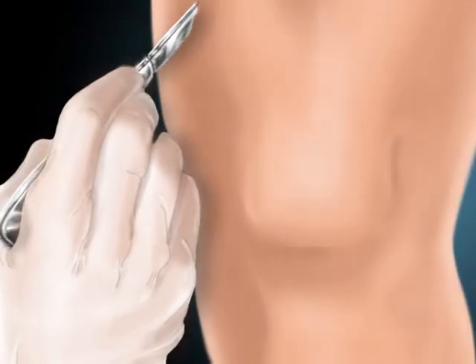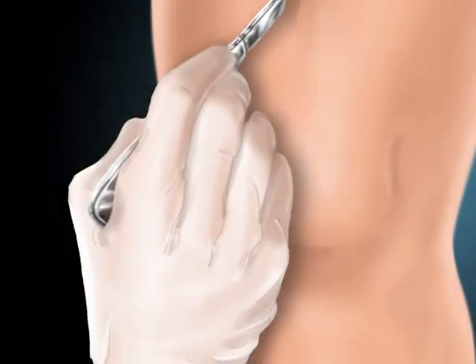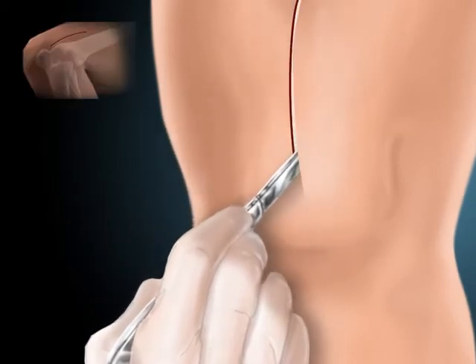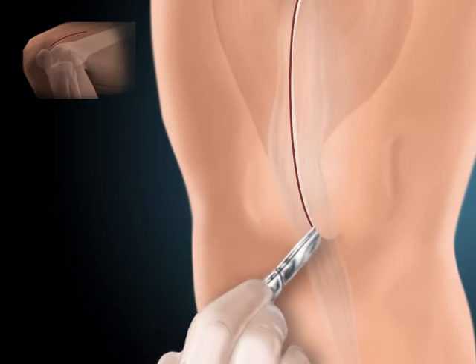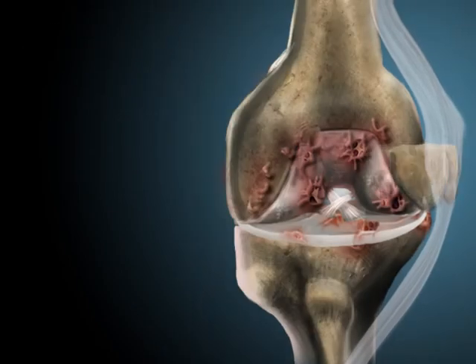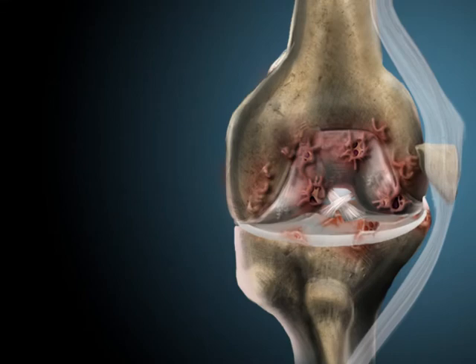An incision is made anteriorly, or on the front of the knee, to allow access to the joint. A deep incision is made to the quadriceps muscle. The patella and patella tendon are then moved to the outside of the knee to expose the femur and tibia.